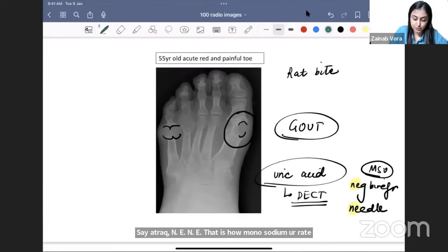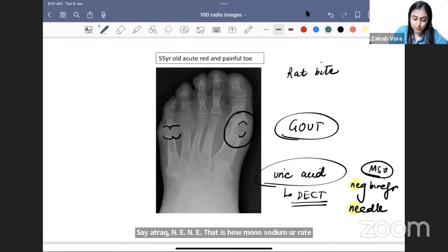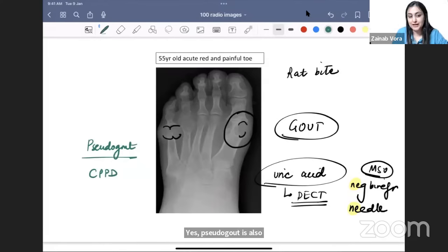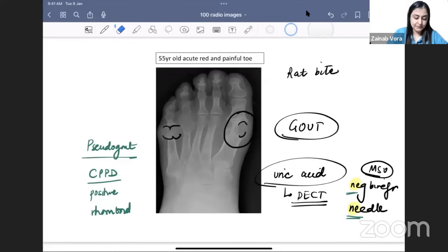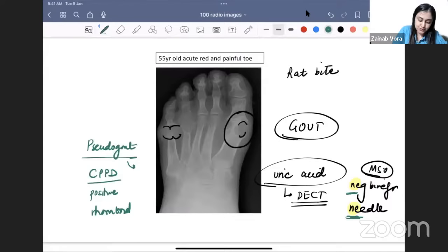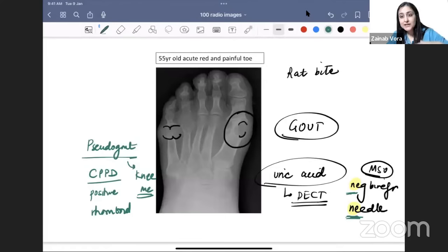Pseudogout is also a crystal arthropathy where calcium pyrophosphate deposits. Since gout is negatively birefringent and needle-shaped, pseudogout is weakly positively birefringent and rhomboid-shaped. The mnemonic: NE NE means uric acid means gout. Pseudogout tends to involve the knee most commonly and presents with calcification of cartilage — meniscal calcification on X-ray.